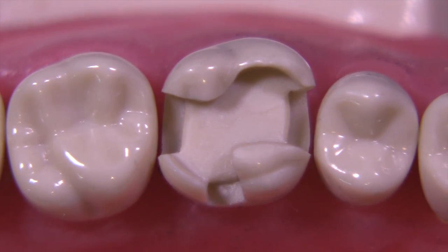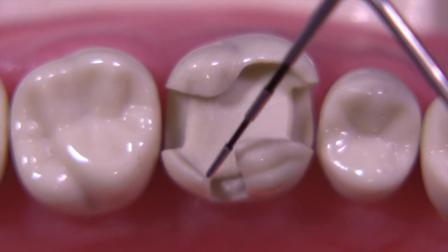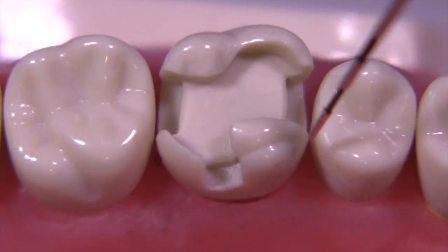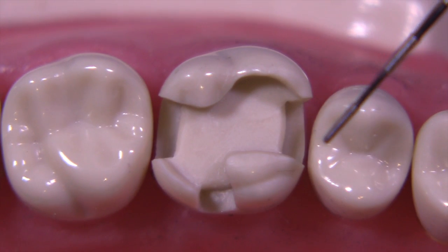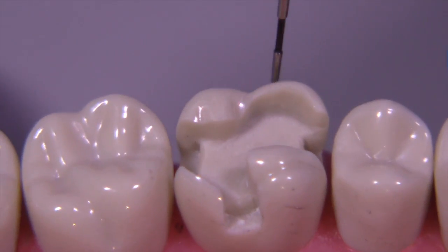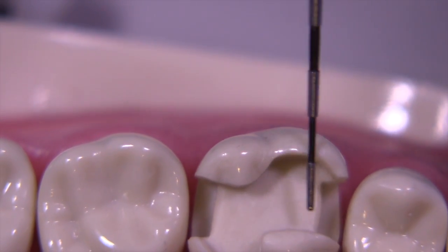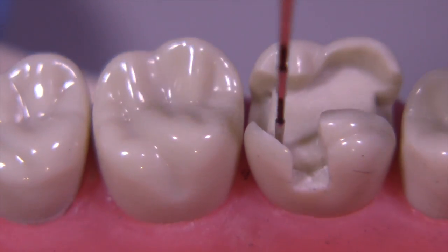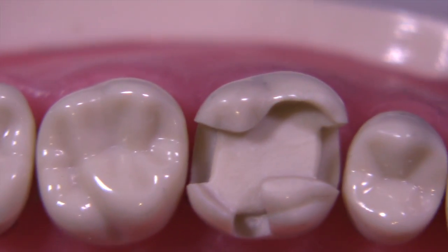After assessing, let's clean this out and do the MOD preparation. I'm not showing all the steps to get to this point since I have a video on MOD amalgam, but this preparation is much larger than ideal. The lingual cusp is really small, the mesial facial is really small, and the boxes are conservative on the lingual side but overextended on the facial side - because the previous restoration determined the outline. The mesial facial and distal facial cusps will be removed, and we want to give the amalgam at least 1.5 up to about 2 millimeters of bulk in those cusp areas so they're strong enough to handle the forces those cusps typically endure.